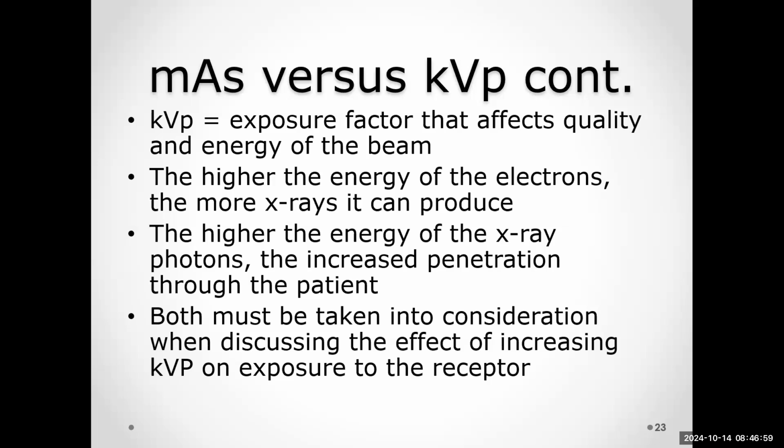Yeah, it makes more splash, right? So basically, those electrons that are going at a higher speed are going to make more splash at the anode. It's going to create more photons. Does everybody follow that train of thought?